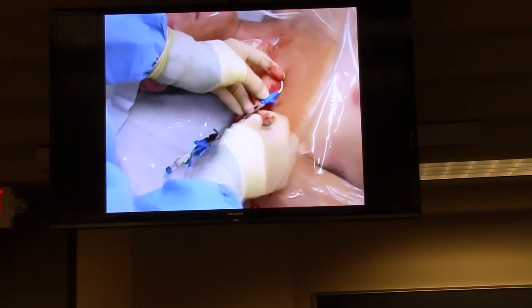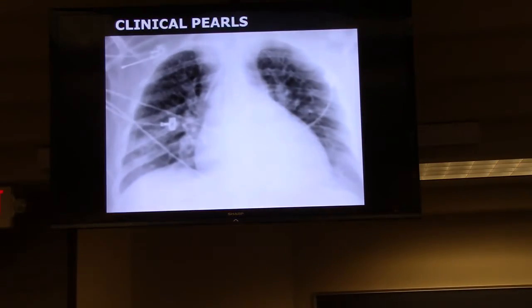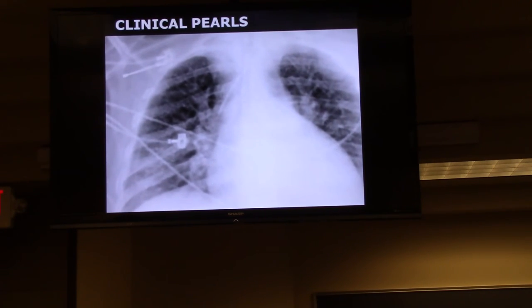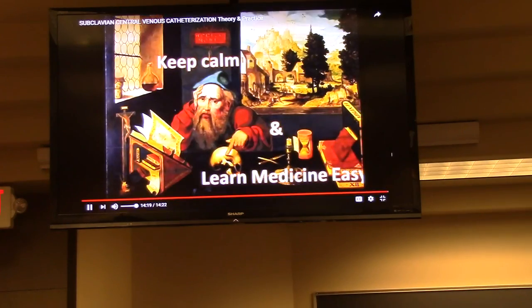Secure the line in place with a stitch and place a sterile dressing over the line in accordance with local institutional policies. A chest radiograph should be obtained after all subclavian line insertions to assess for proper positioning of the catheter tip in the superior vena cava and to evaluate for iatrogenic pneumothorax.